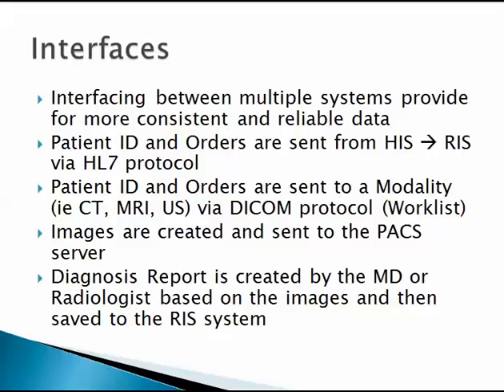Next, a diagnostic report is created by the MD or the radiologist based on the images, and this is also saved to the RIS system. You'll often see, like I mentioned, a report and an image within any RIS system, and you'll also see this within an EMR as well.